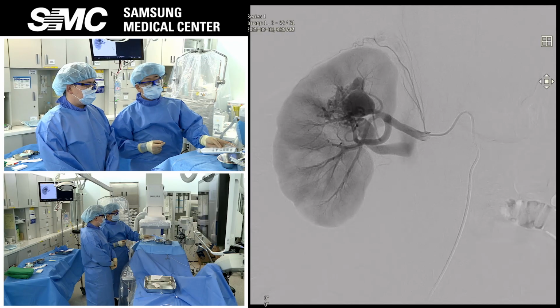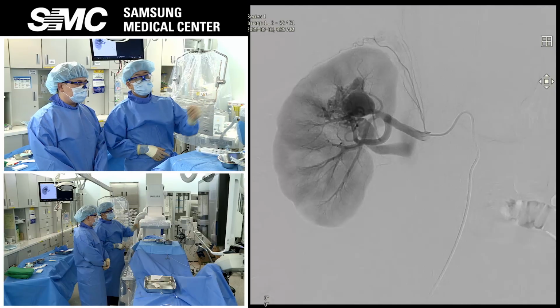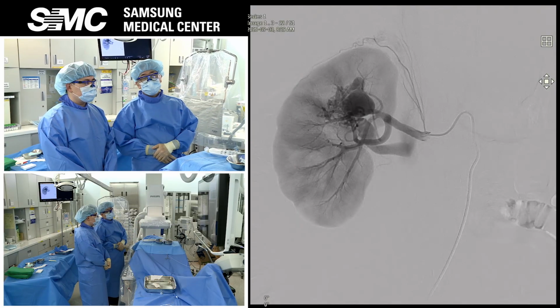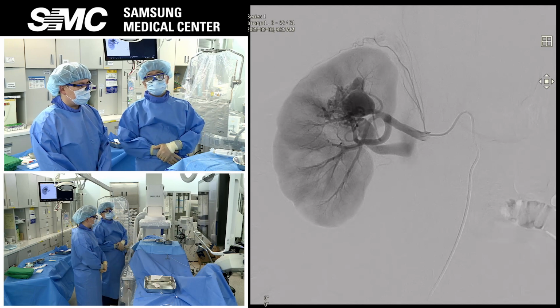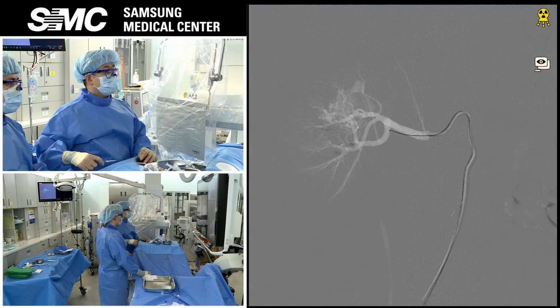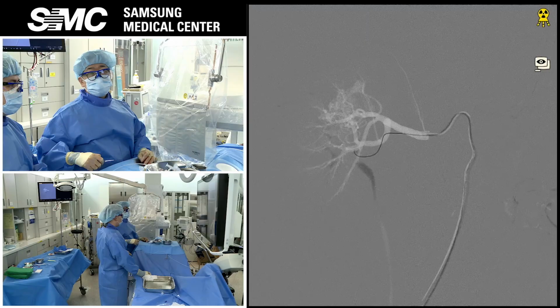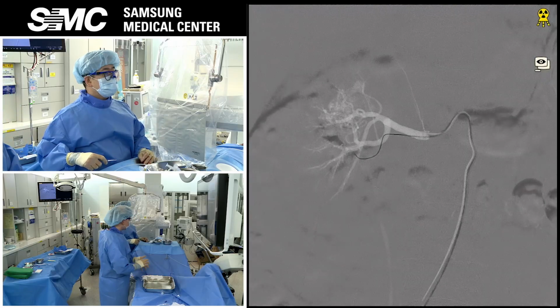So today our first strategy is transvenous access to the venous sac, and then we are trying coil embolization of the type 2A AVM. If the transvenous access fails, the second option is direct stick and coil embolization. Do you have any recommendation on this case? Which access technique is the best for this patient? And do you have any suggestion to treat this case?